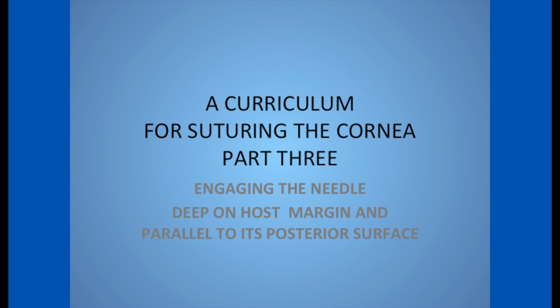And in this Part 3 video, we're going to teach you how to pass a needle into the host, radial, deep on the margin, and parallel to the posterior corneal surface. Welcome to Part 3 of our series of short videos that discuss a curriculum for corneal suturing we've used to train our residents here at Mayo over the past 15 years.